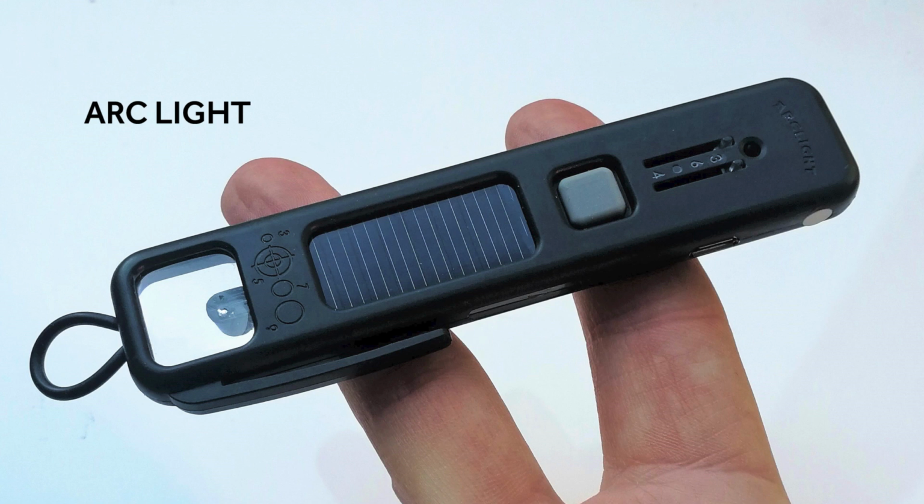The most basic instrument for the examination is the direct ophthalmoscope, and the model we recommend is the arc-light ophthalmoscope. This has the outstanding advantages of its lightweight, being solar or electronically powered, and the use of an LED source of white or blue light. The maximum light source for direct ophthalmoscopy is achieved by pressing the central button on the ophthalmoscope.